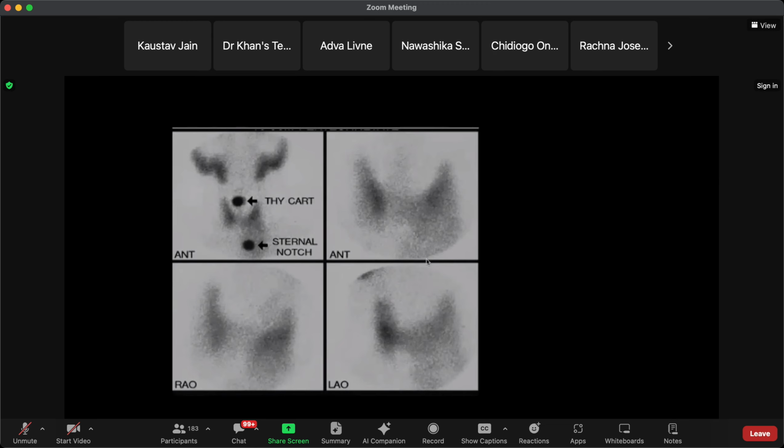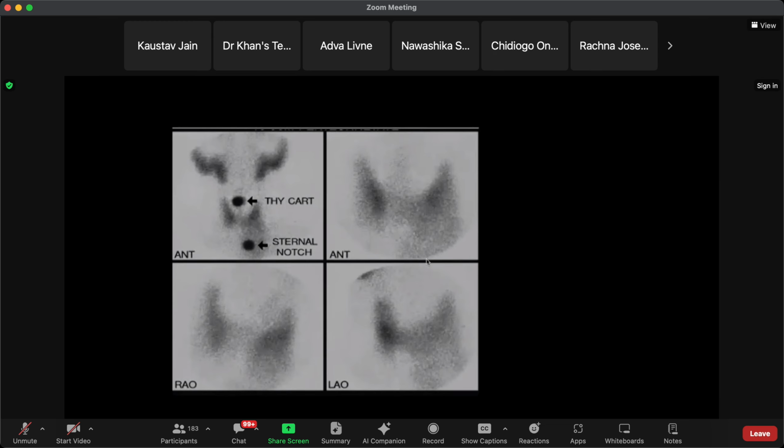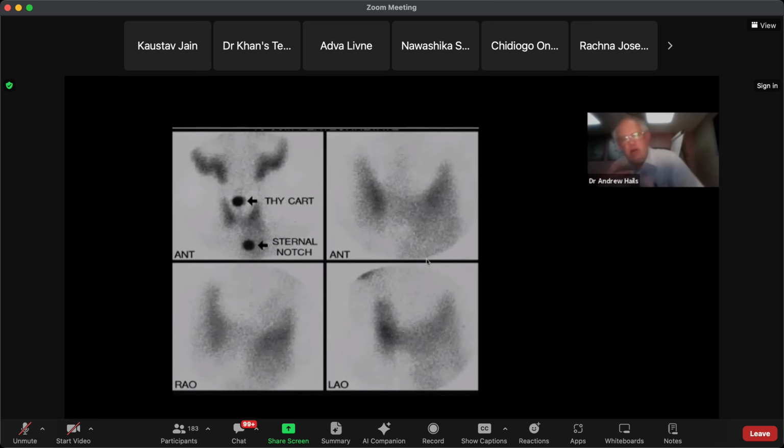I think it demonstrates quite a large thyroid. I'm not sure if on that first image they're focal areas of increased uptake or they're markers. They're markers, okay. So it's just sort of diffuse uptake throughout the thyroid with maybe one area of slightly increased uptake in the right lobe. So basically, what's happened is the patient had the chest X-ray you saw.